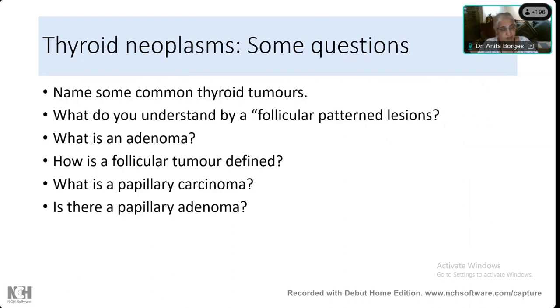So now, Diksha, all those ring-like structures that you are seeing in the thyroid are lined by follicular epithelial cells. There is an epithelium in the thyroid which is forming follicles, and that's why we call it a follicular epithelium. Very good. Now, Swati, what is an adenoma?